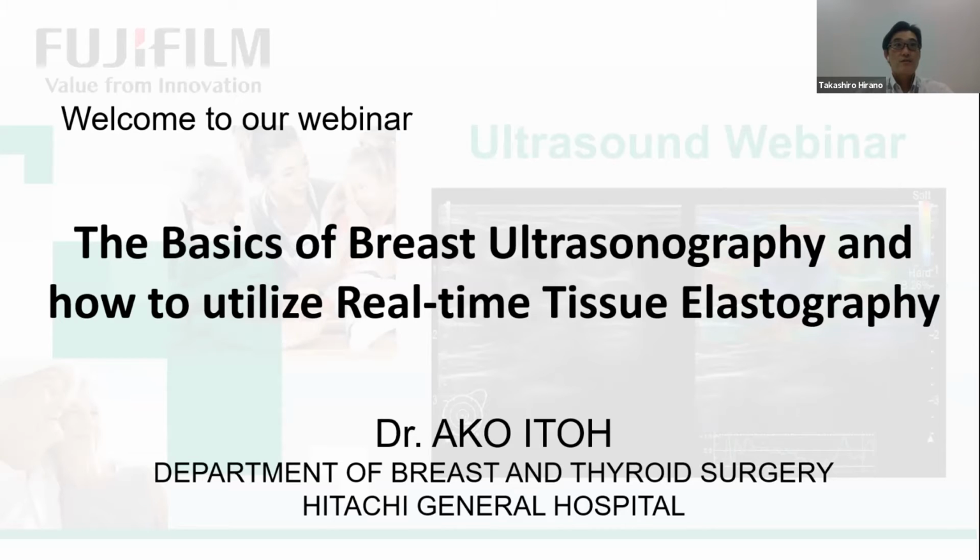Again, welcome to the Fujifilm Healthcare webinar. Today's topic is the basics of breast ultrasonography and how to utilize real-time tissue elastography. Breast ultrasound is now widely used based on the BI-RADS US of the American College of Radiology. It provides high 2D image quality, but sometimes physicians may face difficult cases to diagnose from B-mode findings alone.